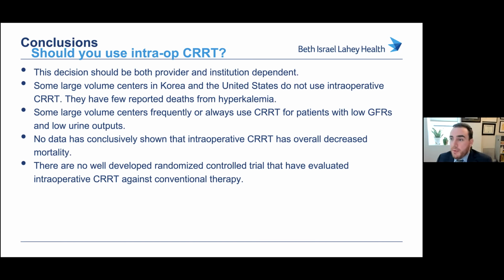We would stop it at that point. Those are generally difficult dissections, and I think having the ability to maintain adequate electrolytes and pH during the dissection phase is going to be very helpful for us, even when we're anhepatic, if we don't have it.